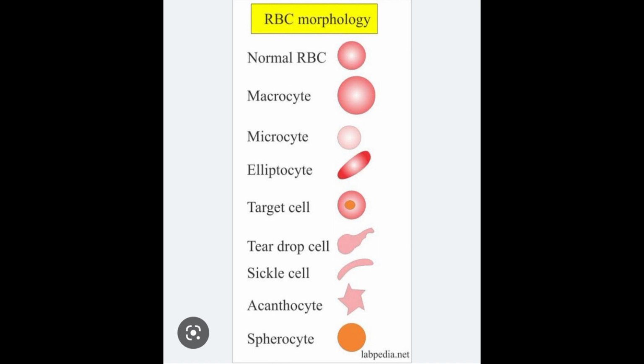Target cells. These are also known as leptocytes and their presence is known as leptocytosis. The shape of the target cell is bell-like or hood-like. They have a central stained area. Such RBCs are seen in hepatitis, thalassemia, etc. Ovalocytes. These RBCs are oval in shape. A lower count of ovalocytes may be considered normal. However, a higher count is associated with various anemias.